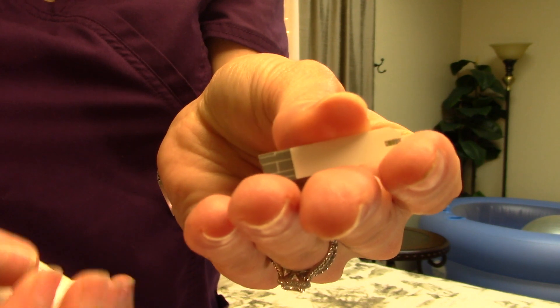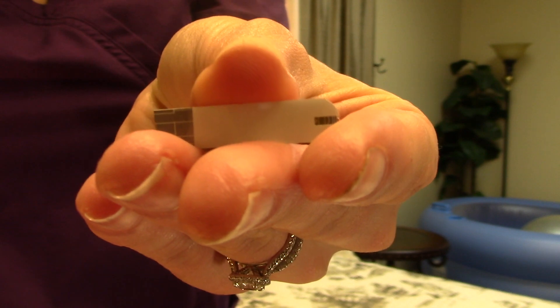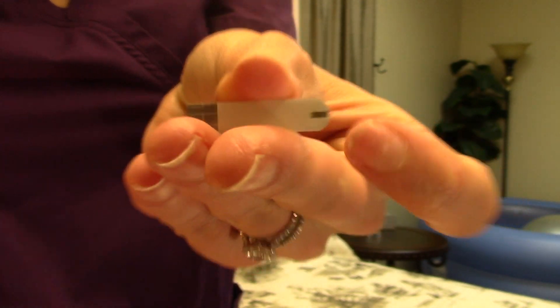Here's a look at the test strip. This section is going to go in the glucometer, and this little piece right here on the tip is where we're going to insert our little droplet of blood.